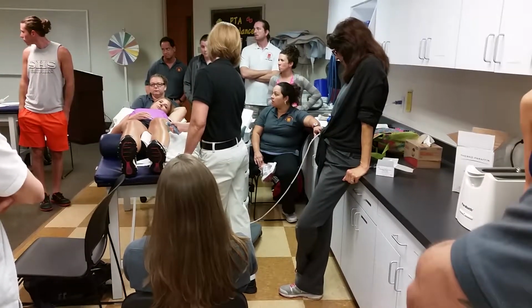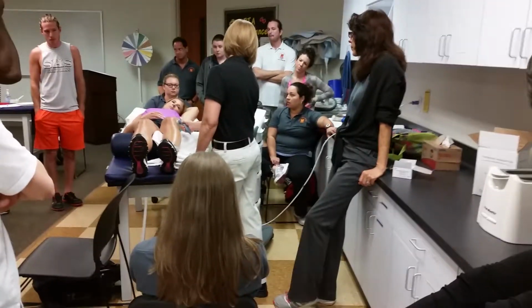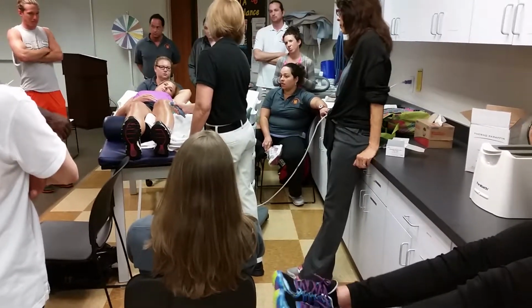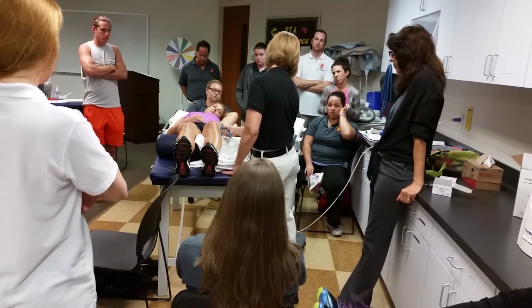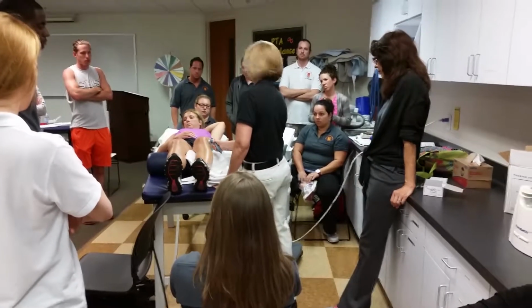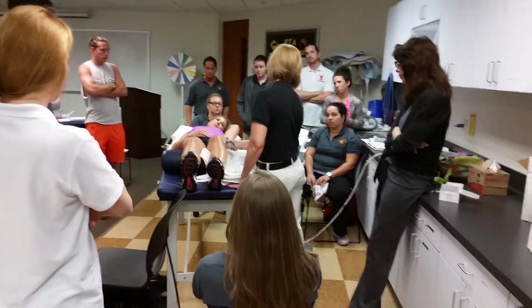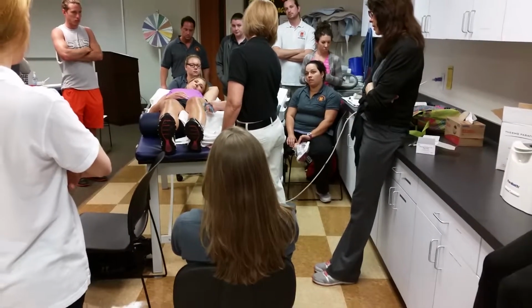So I would document: I did 8 minutes of continuous ultrasound, increasing to 1.0 watts per centimeter squared, to the iliotibial band, distal component, lateral aspect. You don't even include the duty cycle? I said continuous. That goes under objective, yes, that's the application. Under objective goes your treatment and any measurements that you've done, and all aspects of treatment, by the way.